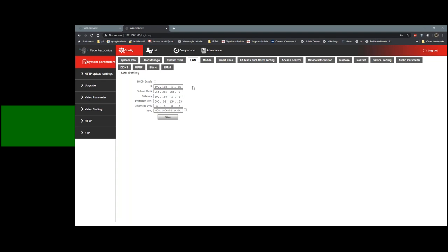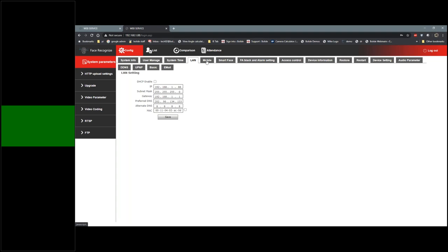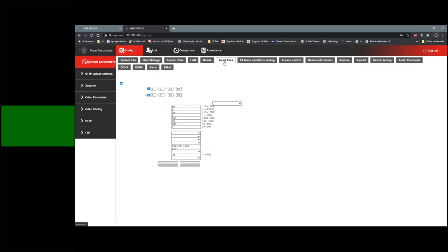Basic information includes subnet mask, your gateway (which is your router), and your preferred DNS. There's also a mobile access tab that will be available in a future software update — it's already in the GUI. Next is the SmartPass menu, which is a really important menu to go through.